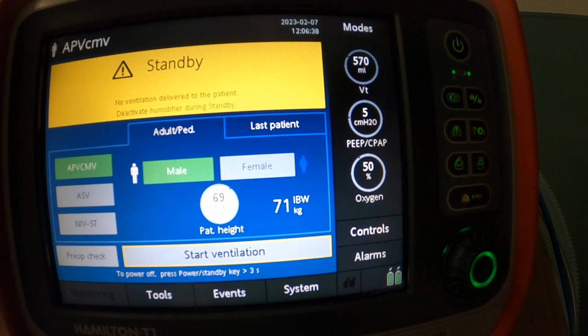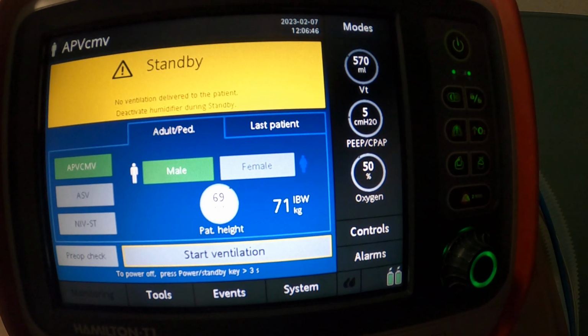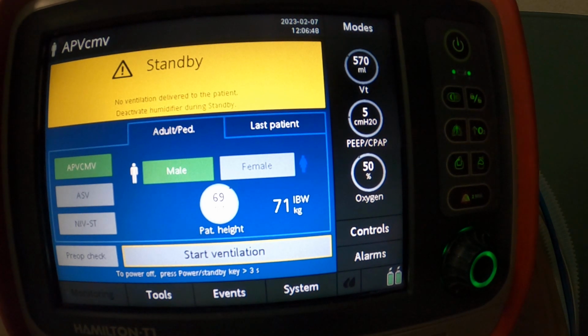So a patient you may run into would be a patient with restrictive lungs. Now, restrictive lungs, we've got to consider this is a person who we're having issues ventilating because their lungs are extremely stiff. They're hard like rocks. It's like a bowling ball. You're trying to push air into the holes of a bowling ball. You're trying to stir a cake batter that's so dry and stiff.